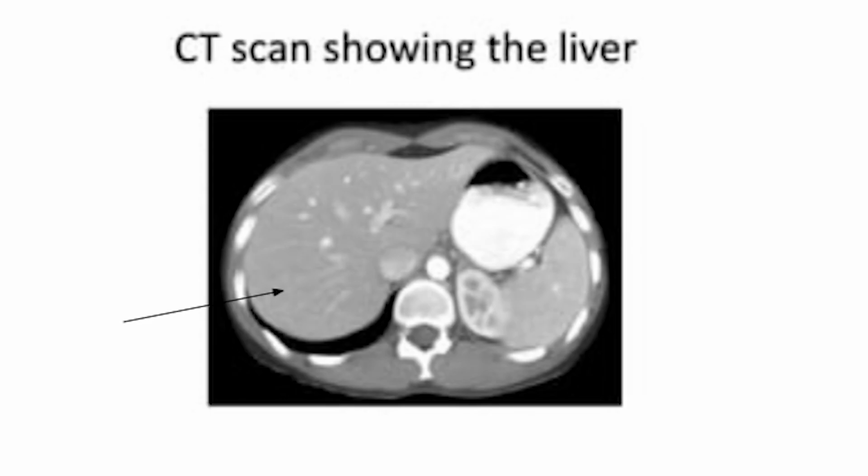I have shown in this slide CT scan of the liver. I have also shown the CT image of the mid abdomen where you can see various parts of the abdomen. You can observe from these CT images that the CT images are clearer and can offer better images in case of soft tissues as compared to conventional X-ray images.